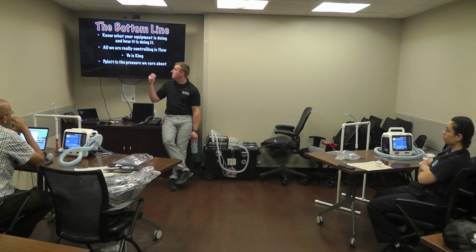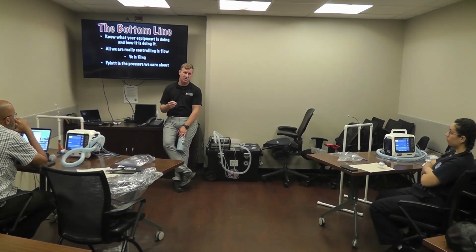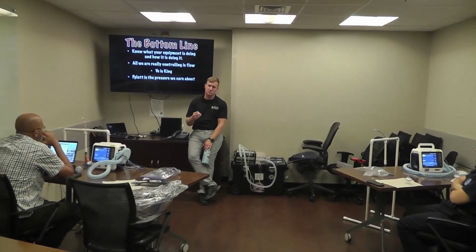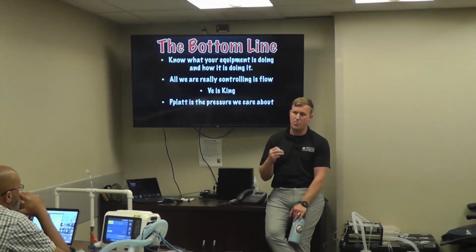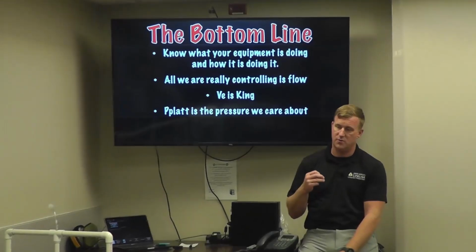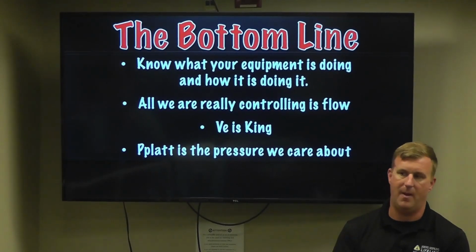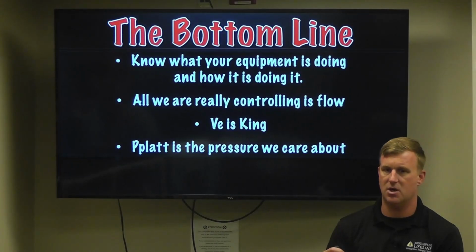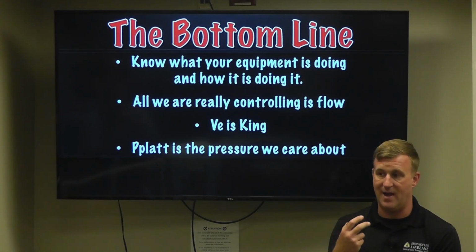So my big takeaways is, like I said, know your equipment. Minute ventilation is really important, and understanding that minute ventilation is probably one of the most important aspects that you can understand about mechanical ventilation. Plateau pressure is the pressure we care about. So if you have a volume ventilation, you need to understand what that plateau pressure is. I don't really care about peak inspiratory pressure in a volume ventilation because it's dirtied up by the upper airways, by the ET tube, by whatever they might have in their ET tube.